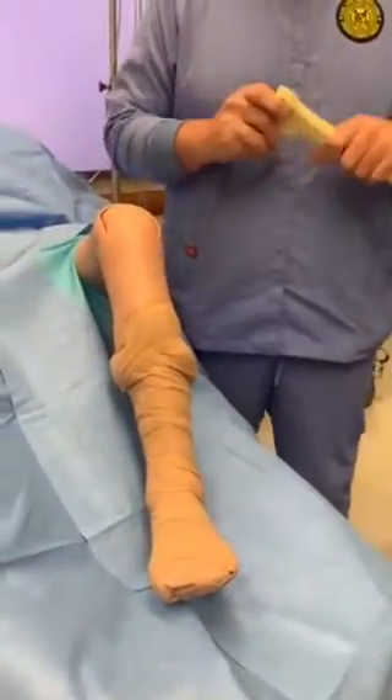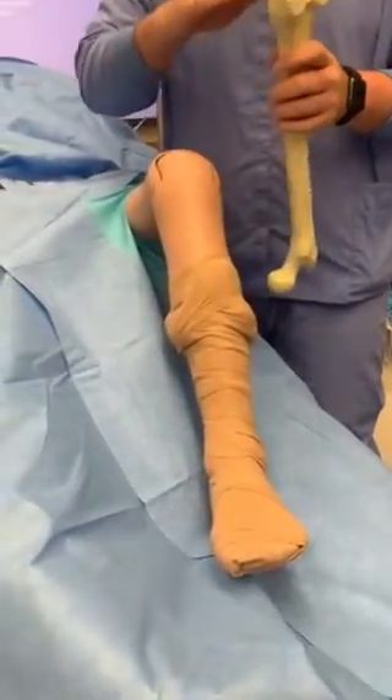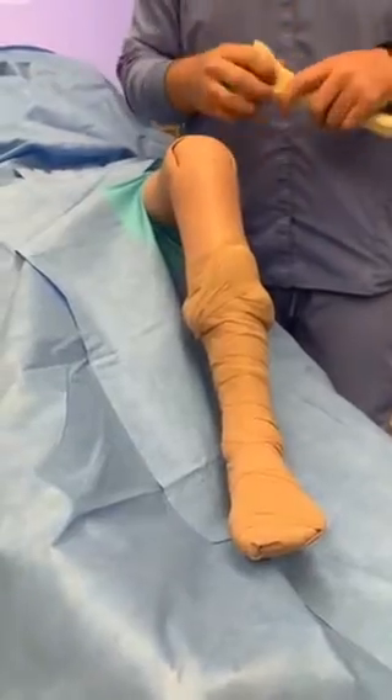Then they start with the femur, and they'll attach a cutting block to the femur that has different slits in it that they'll use.